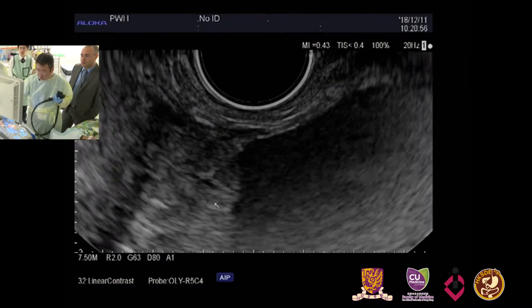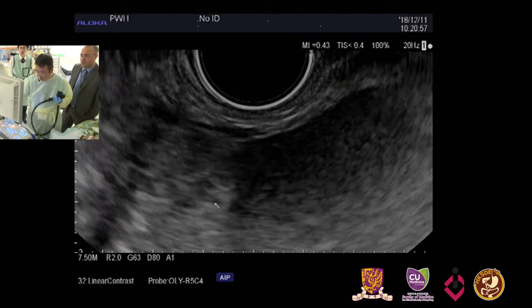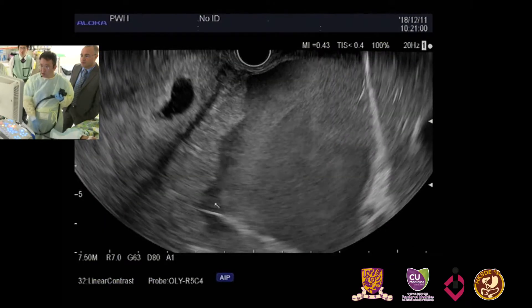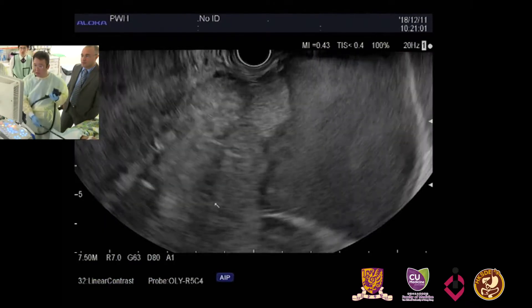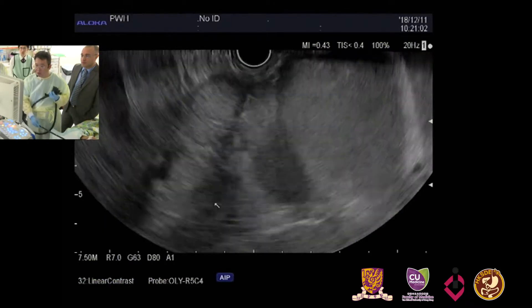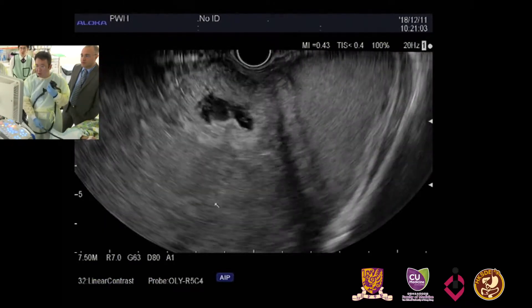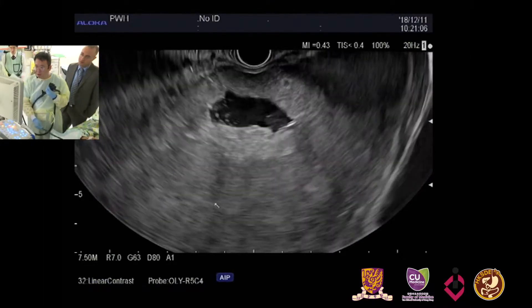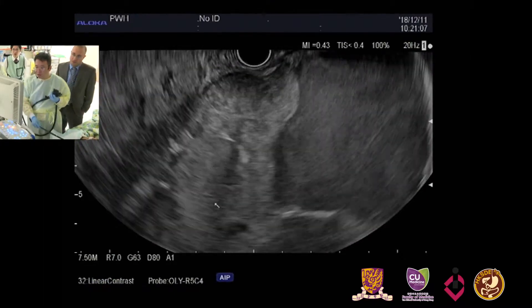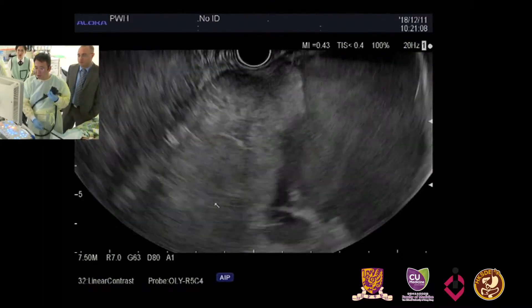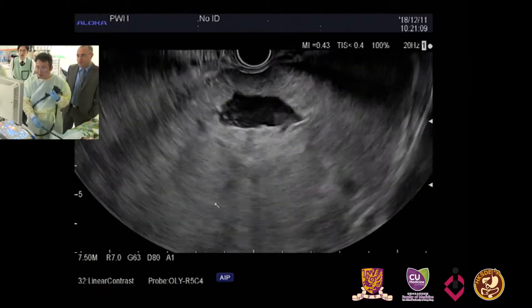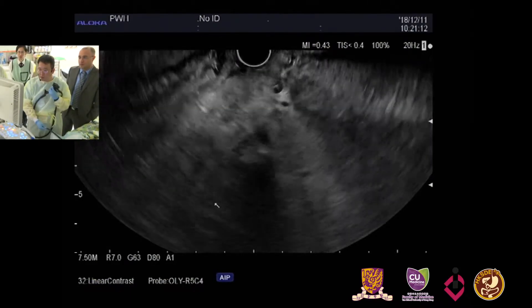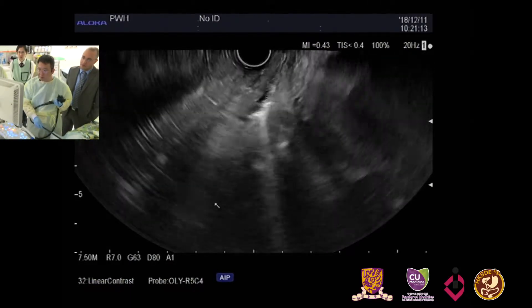So today what I am doing is obtaining tissue, because some oncologists want to have neoadjuvant therapy with imatinib to make the tumor smaller, which may make surgery easier to perform.